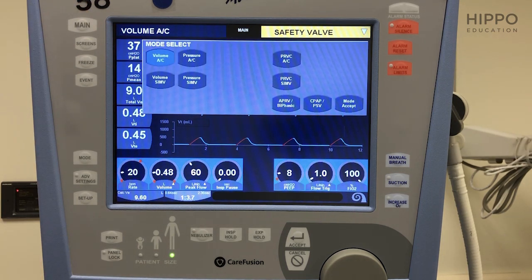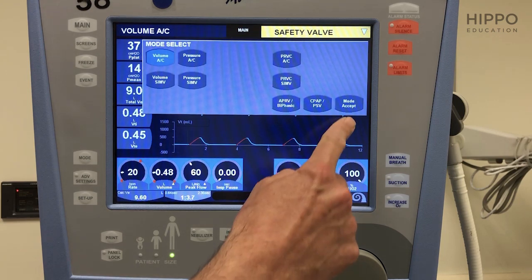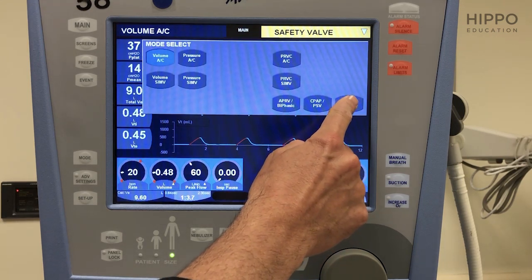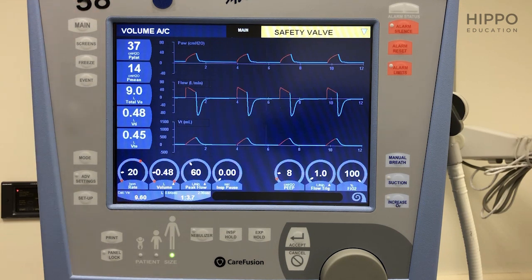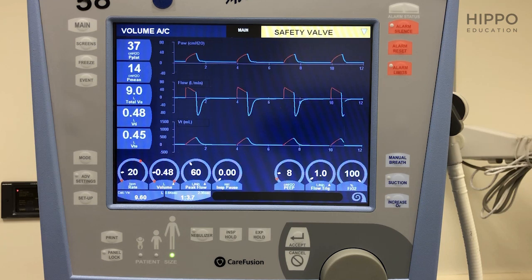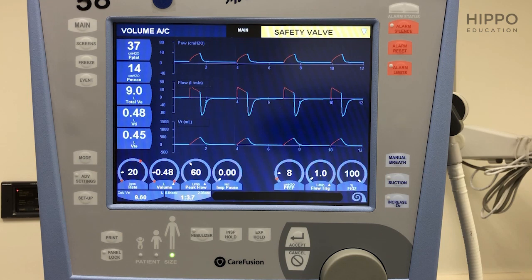Remember that every time you make a change, you have to accept. So mode, accept, and now volume assist control — you're ready to roll. The next step is those parameters we talked about: the four essential parameters that you can adjust based on your patient.